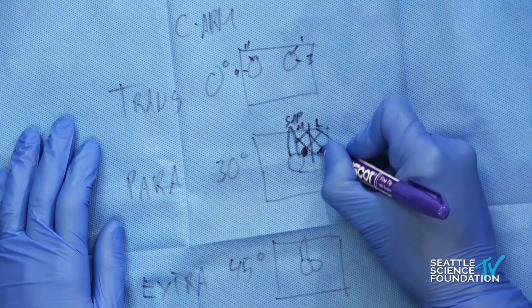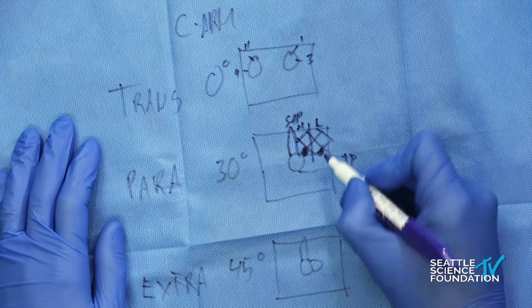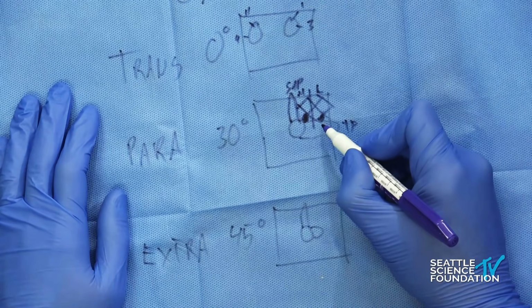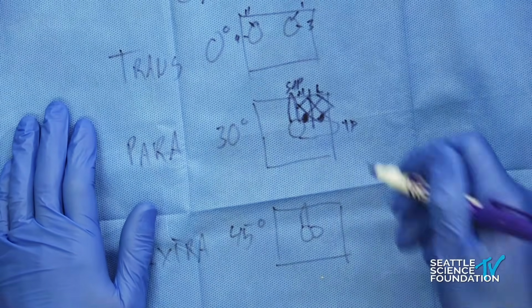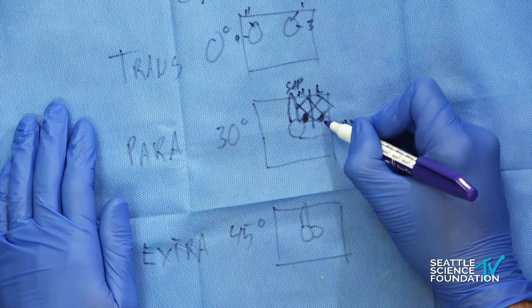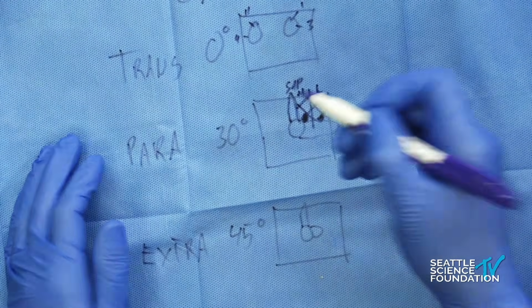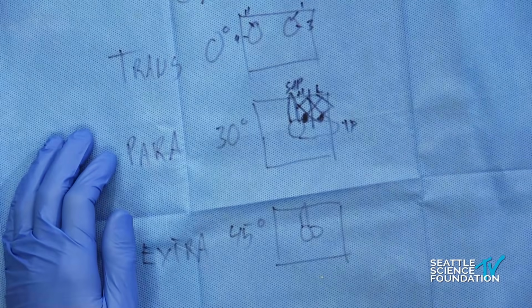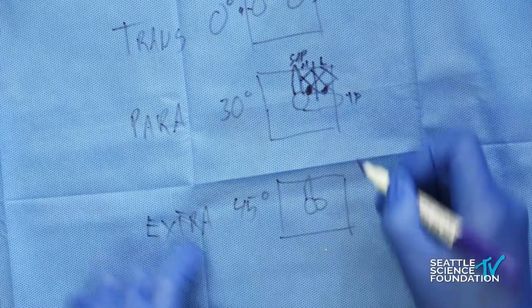If you go a little bit more lateral, you'll be already past the posterior wall of the vertebral body. So this is an extremely fast way to access the vertebral body. You're away from the nerves, and you'll be right in the center of the vertebral body. So very easy access. I would say probably most of my lumbar accesses are done with a parapedicular approach. For the purpose of the demonstration, we'll use a mixture of transpedicular and parapedicular approach today.